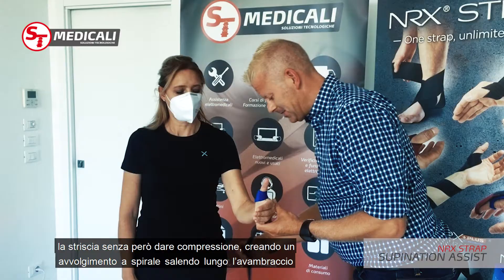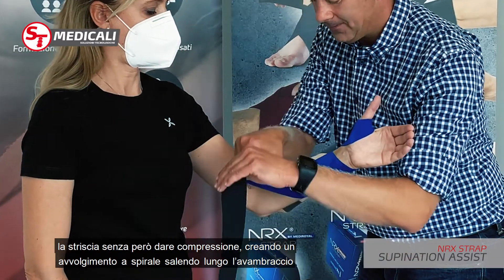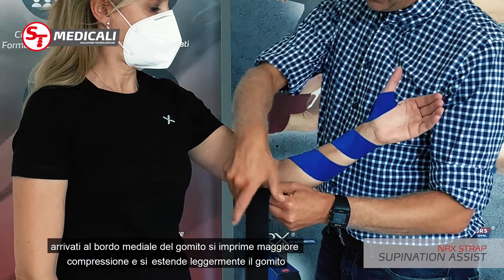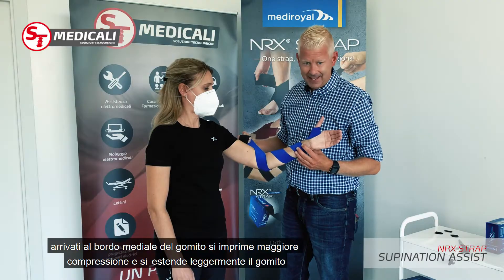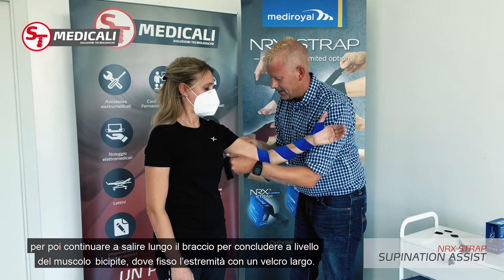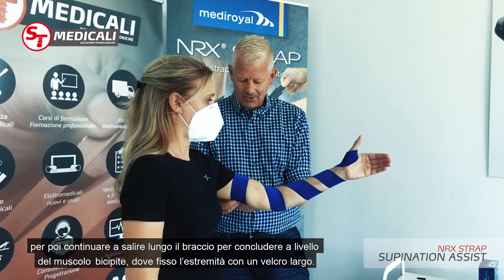I put the patient in neutral if possible, then pull the strap with very mild compression, creating a spiral going up around the forearm. Once I get onto the medial aspect of the elbow, I can pull a little more compression there to extend the elbow as well, then pull the strap around the biceps and attach it with a wider hook on the other side.